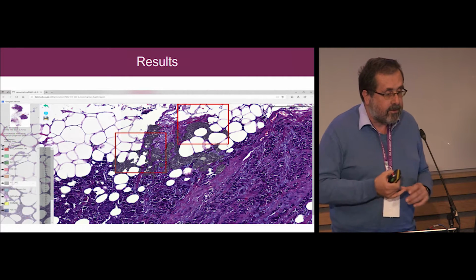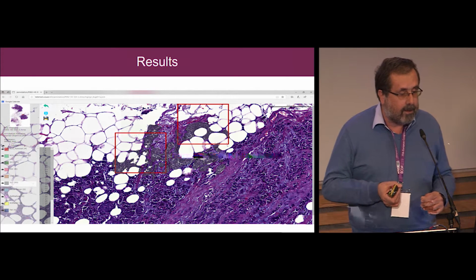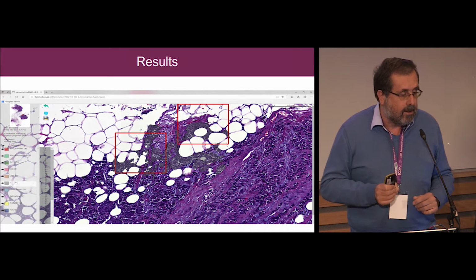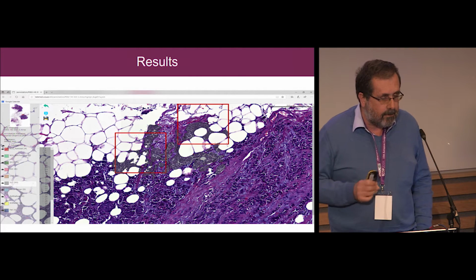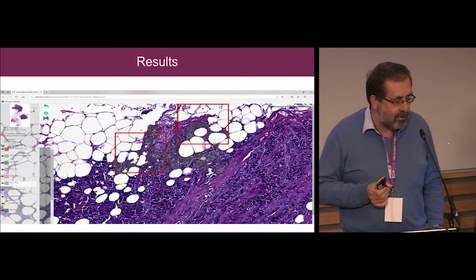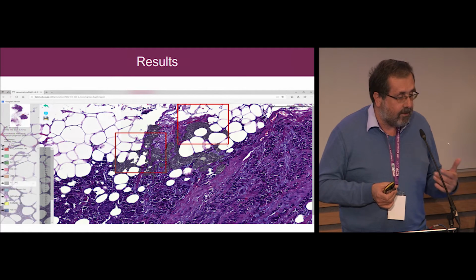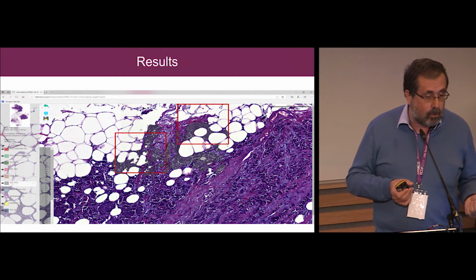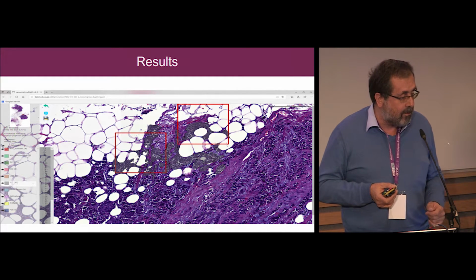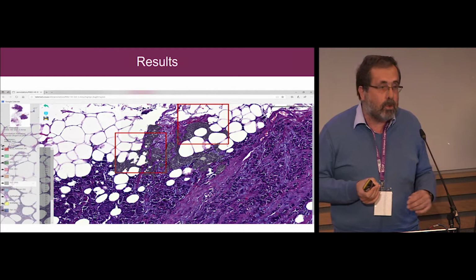And in fact, what the pathologists and technicians did was selecting and annotating, a very hard work to do, we will see now how many tiles we annotated, and separating also whether it was infiltrating lobular carcinoma or ductal carcinoma.